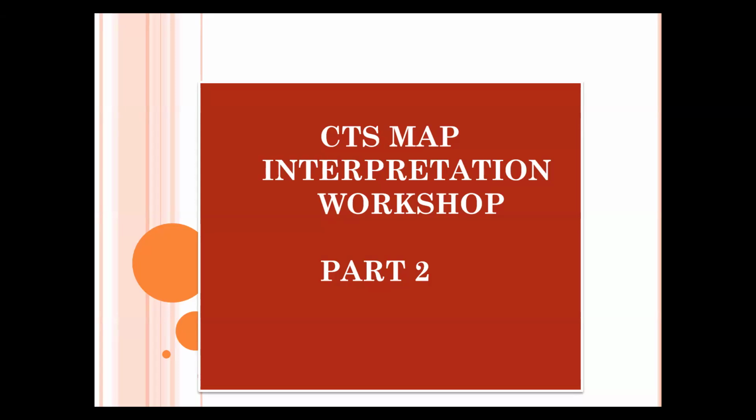I agree with you totally, Dr. Ohabike. I don't think the essence is just to tick a box, just like you mentioned. Even though this is an upgrade and we believe we have knowledge of the CTS already, this is one area that we've not really explored. It will be useful to have another day to go through part 2, because part 2, I know, is the most important part, which is interpretation. So I think it's better we have another day.